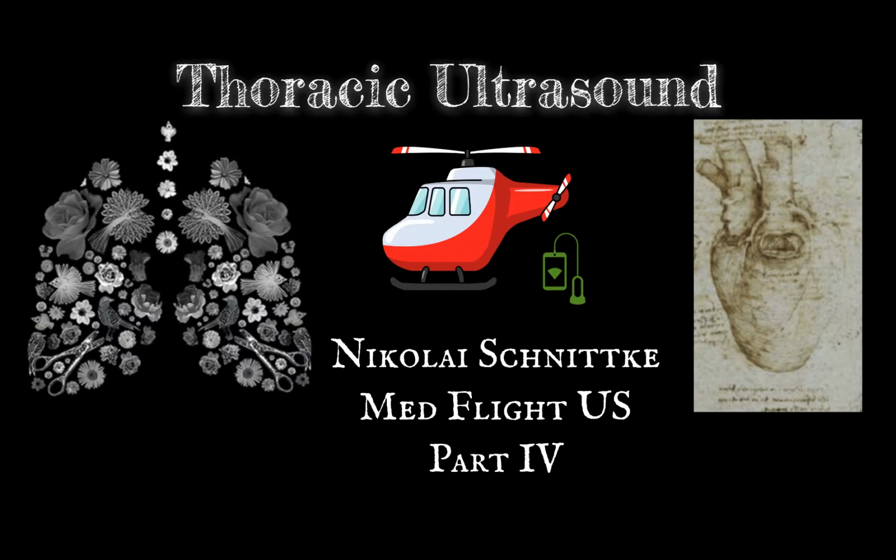Welcome to the final session of the core MedFlight ultrasound curriculum. Today we're going to talk about what I think are the most exciting pieces of resuscitative ultrasound, which is thoracic or cardiopulmonary ultrasound.